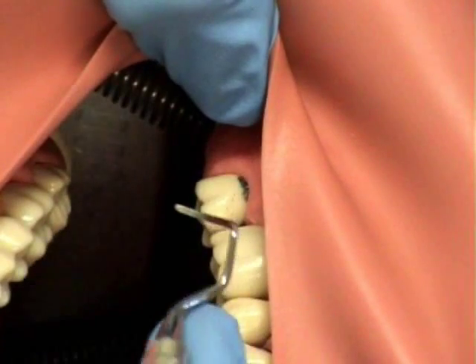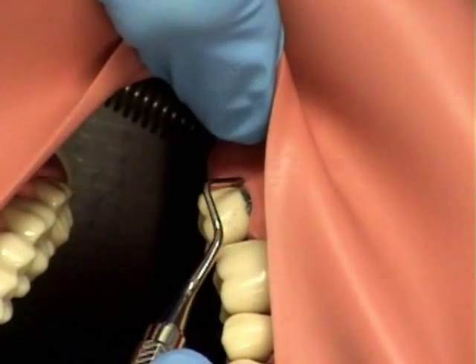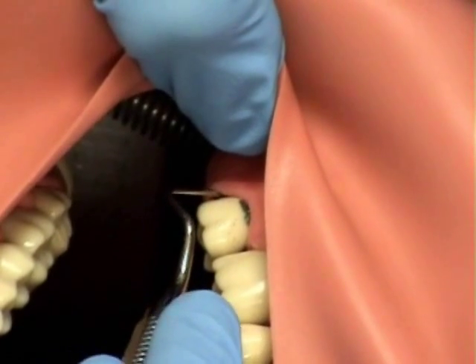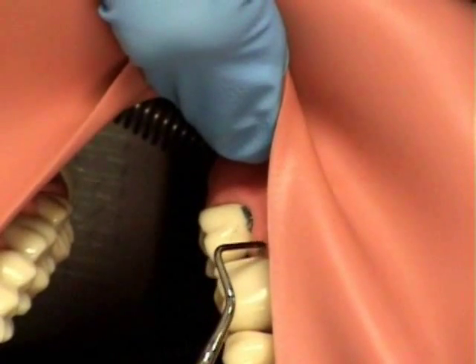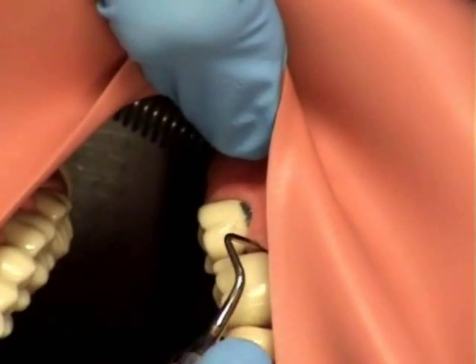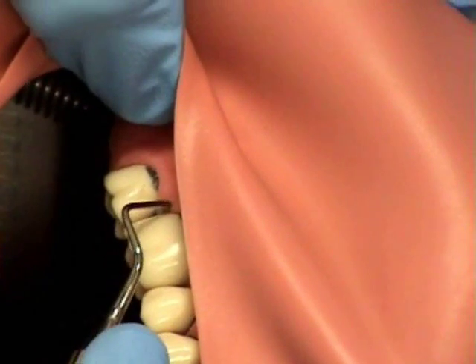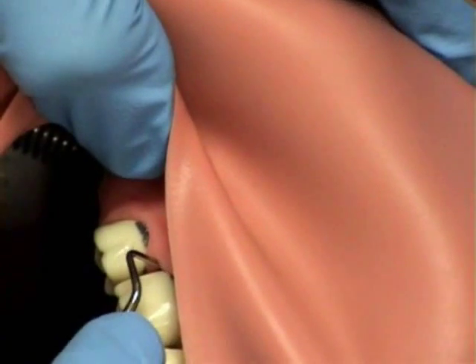After completion of the mesial surfaces, the 1718 can be used for the distal surface. With the extra bend in the shank, access is much easier on the distal surface with the 1718. You begin at the distal buccal line angle and move the instrument distally with an exploratory stroke. When a deposit is encountered, you open the blade, tighten your grasp, and activate the stroke.